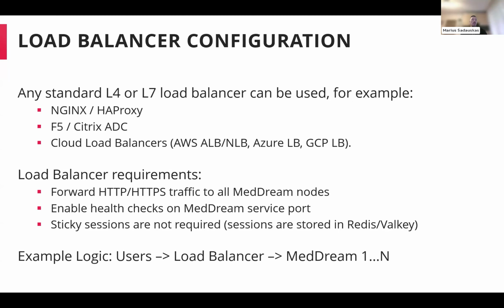It should have some health checks option available. So it could check that the MedDream service is up and running, and the sticky sessions in this case are not required because the sessions are stored in the Redis or Valkey service.